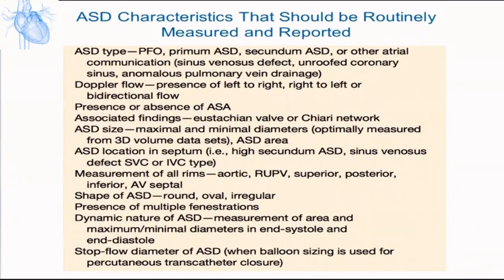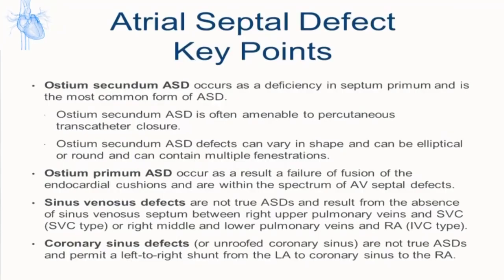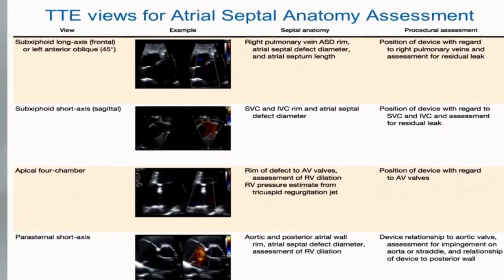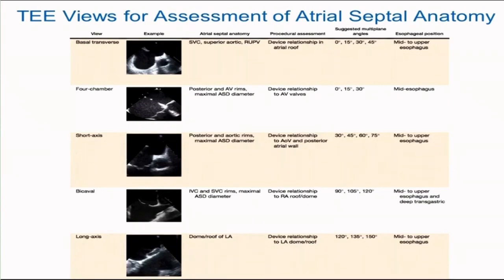ASD characteristics that should be routinely measured and reported include: ASD type, flow direction, presence or absence of atrial septal aneurysm, associated findings, ASD size — maximum and minimum. The 5 basic TEE views for assessment of septal anatomy use angulation between 0 and 135 degrees: basal transverse view, 4-chamber view, short axis view, bicaval view, and long axis view. Probe position should be mid to upper esophagus.